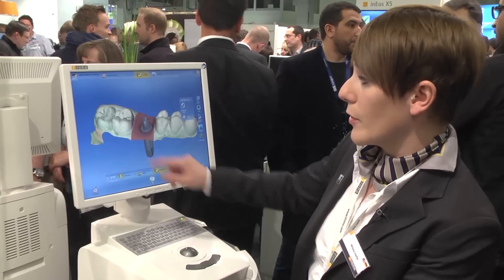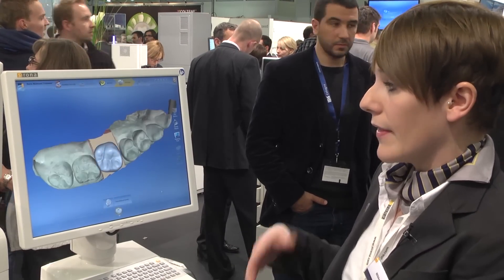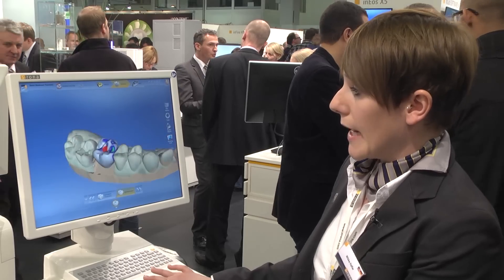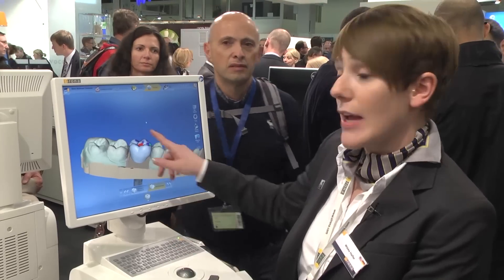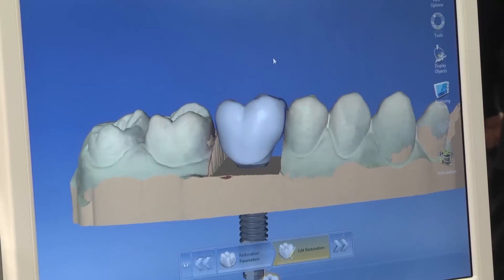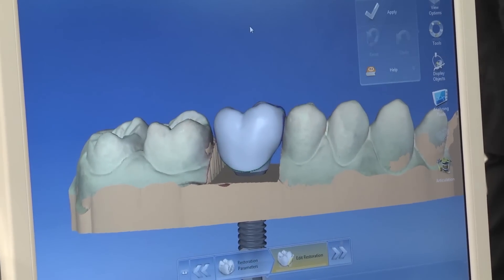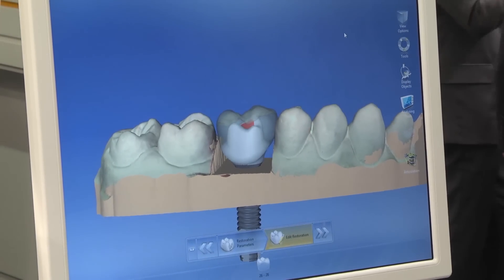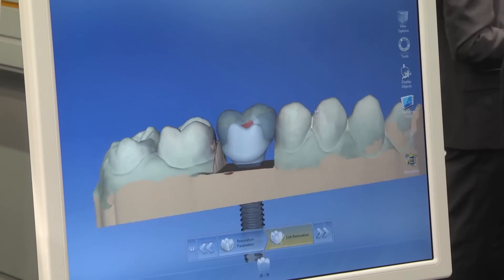You see the blue line for the emergence profile, and clicking one step next, the biogeneric works just as before — we already have a full anatomical crown with a hole for the sprue. If you don't want it in one piece, you can split the case with just one mouse click. Apply, and within three seconds we receive an abutment and a crown, which are then sent to the milling machine — a single crown and a single abutment milled at the same time.